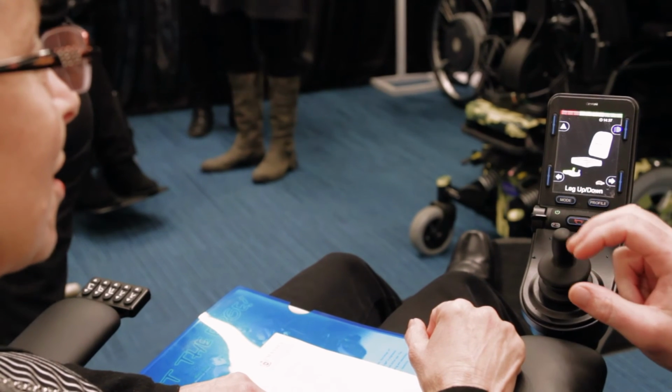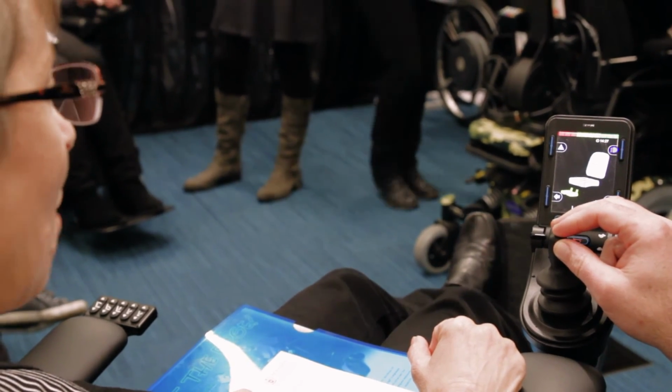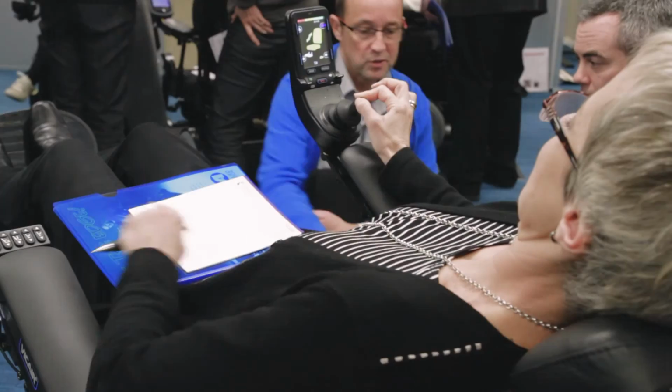Piecing together your multiple functions and your alternative access is tricky. Because when you're scripting up a chair, you can say, oh, they need this, they need this, and they need this, and oh, they need to do that too, and actually, what's the end result like? So, like I said before, for some people, less is more, but in saying that, there are people out there who are managing these chairs. There are chairs set up out there which, certainly with practice, you can learn, but it's about putting it together and choosing the most essential functions depending on what your client can do.